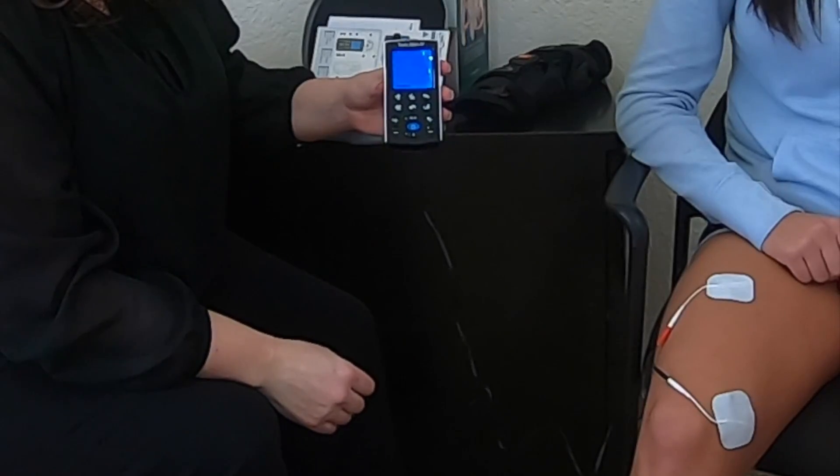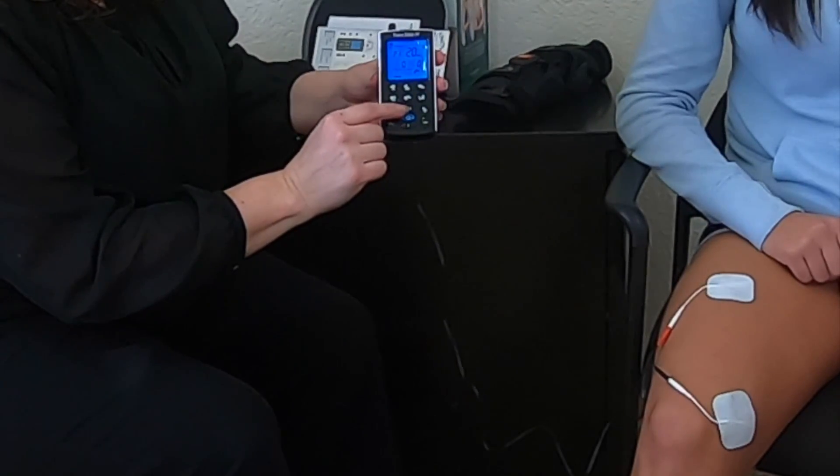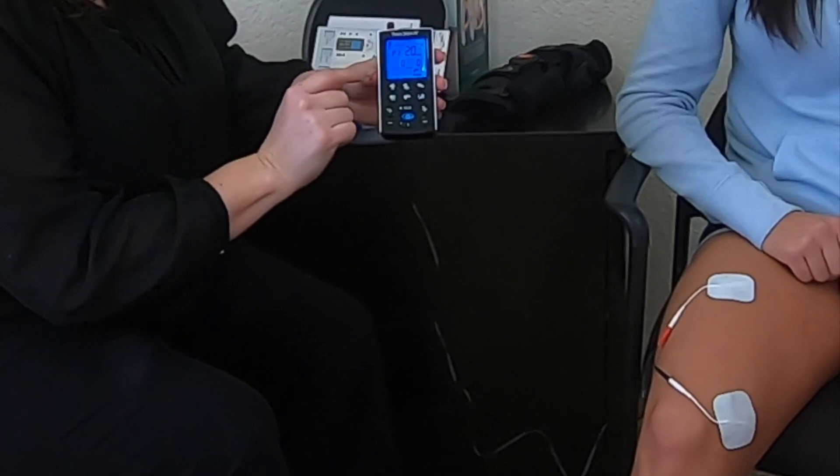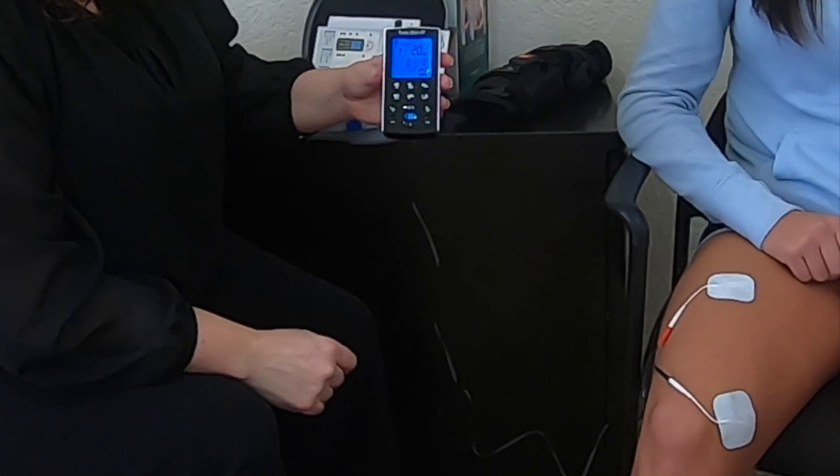Turn on your device with the blue button in the middle, then hit the mode button because you want it in NMES — right now it's in TENS. Hit the M button so it says NMES in the right-hand corner.